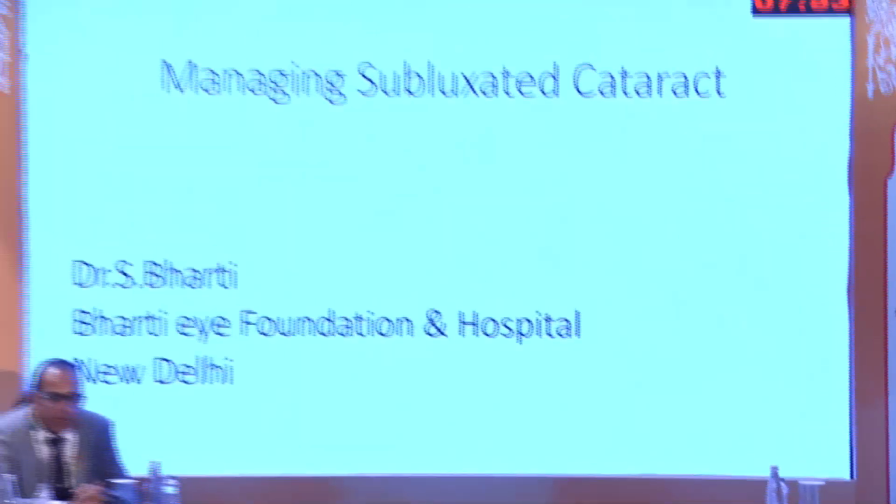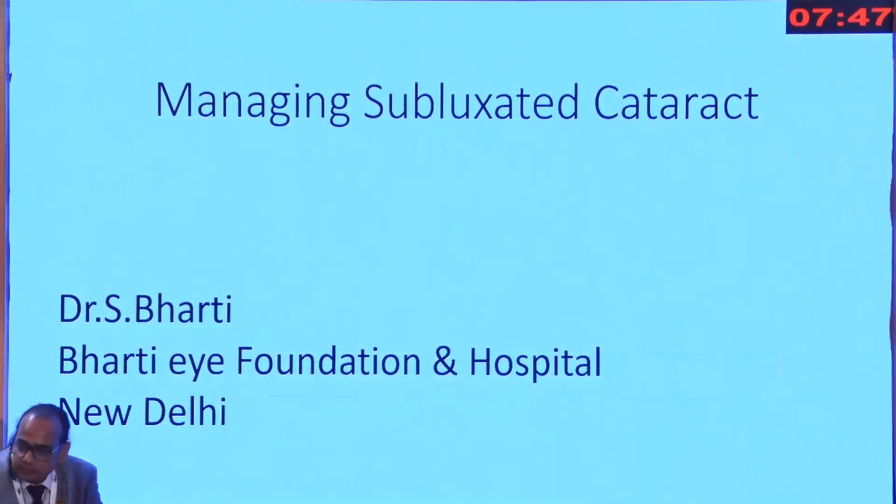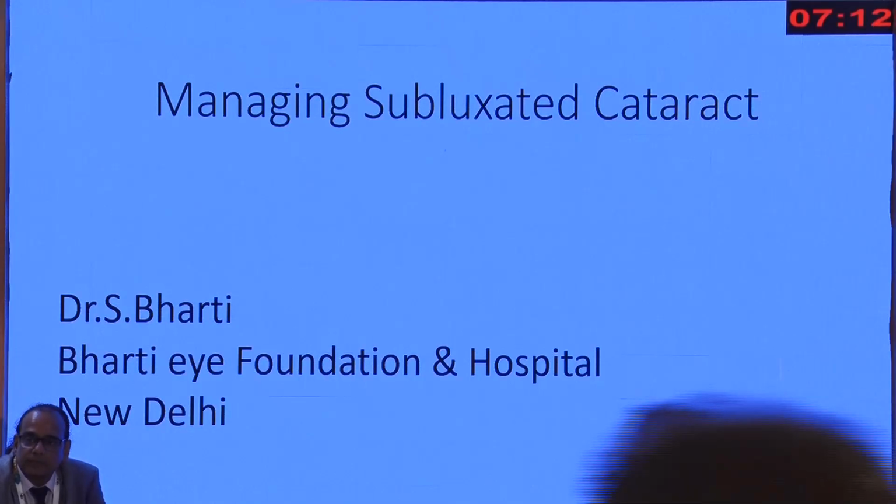Sometimes when you have these subluxated cataracts, a lot of things come to your mind as to how to manage, and what happens if something goes wrong intraoperatively. Then your hands and feet swell up, and then you come back and think what to do and how to manage. On top of everything else, the patient doesn't realize how many micro infarcts you have gone through while doing this kind of surgery.